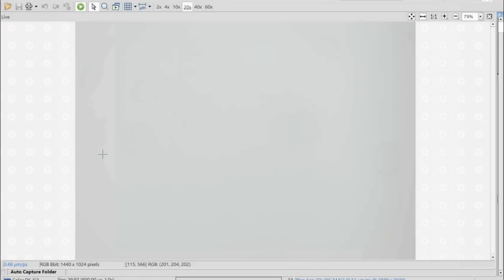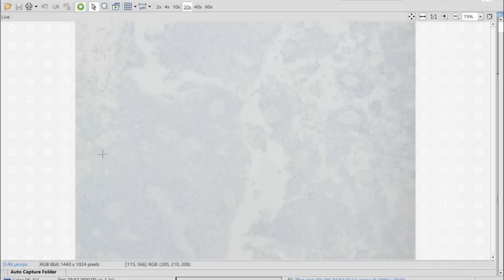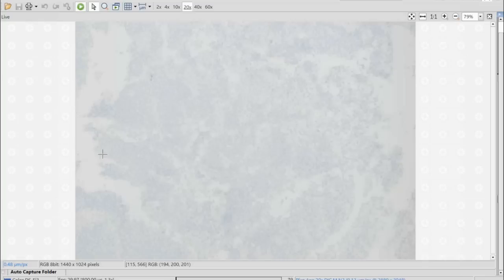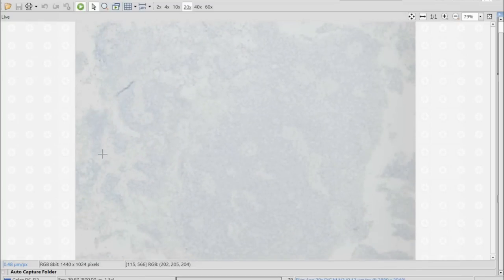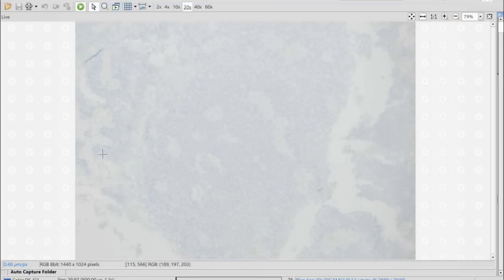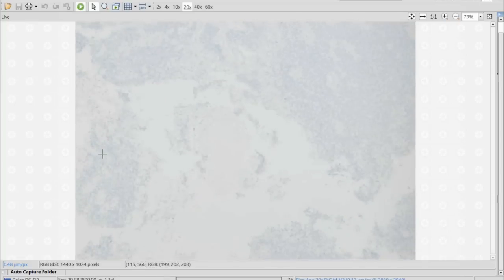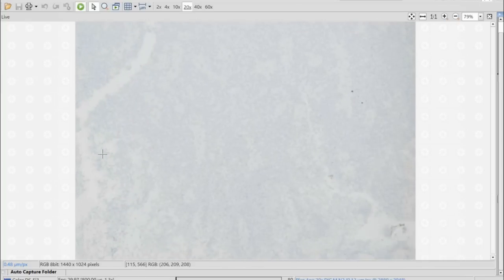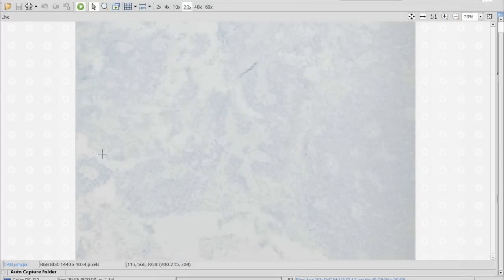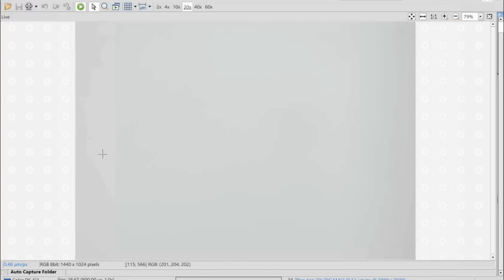And I'm gonna show you some stains. First stain is OLIG2. And we use OLIG2 a lot as a marker of gliomas. It's not present in every case, but it's relatively sensitive and relatively specific for glial tumors. And ependymomas are almost always negative for OLIG2. You may have a few rare cells entrapped, but it's one of the first stains that we use to screen. So ependymomas are usually GFAP positive, as astrocytic tumors and other gliomas are, but they are OLIG2 negative for the most part, like this case shows.